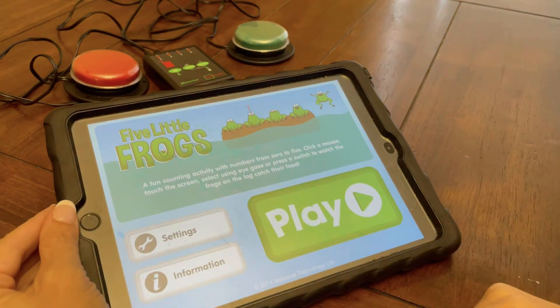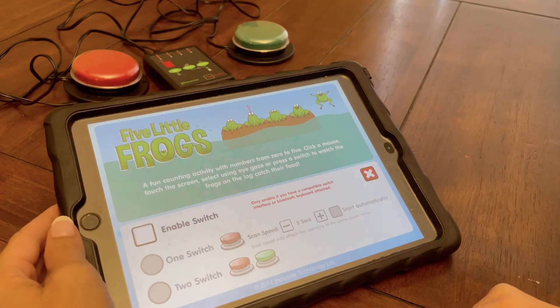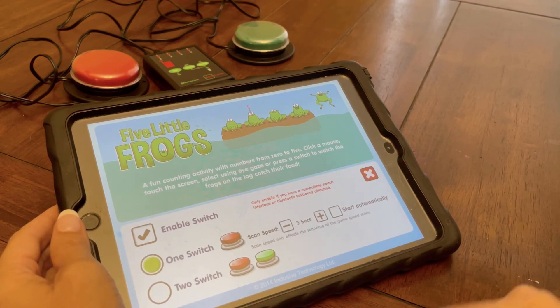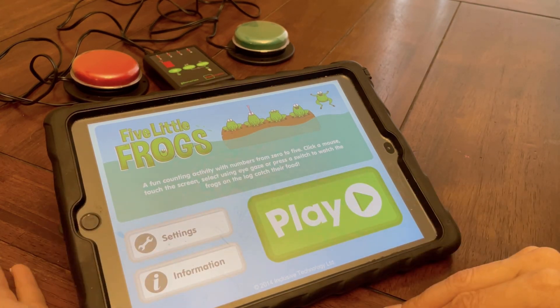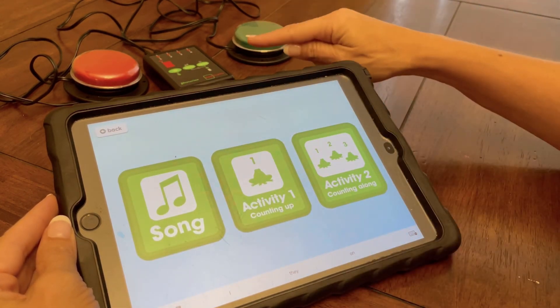Still, other apps are actually switch accessible, in which case you will tell it that you're using switches, but you don't have to go into Switch Control as long as your Bluetooth is paired.